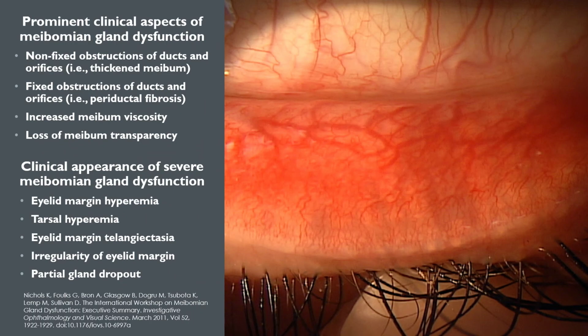Here's a real life picture, of course, of the eyelid. And if you don't have a meibographer, this is the best you can do. I'm not going to belittle optometrists that don't have meibographers, but you should go get a meibographer. Until then, if you don't have one, then plan B, and plan B is okay. I went plan B for years, so it's not the end of the world.